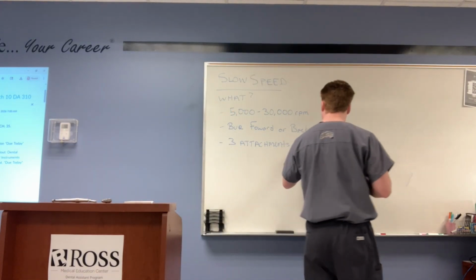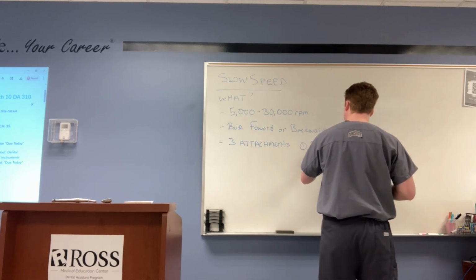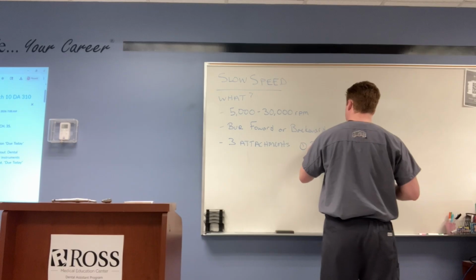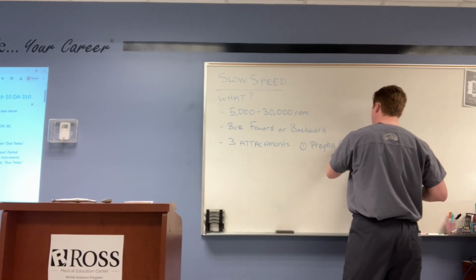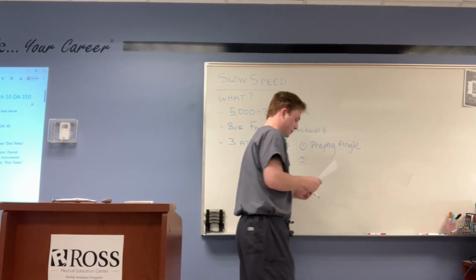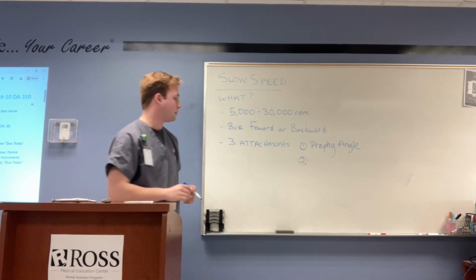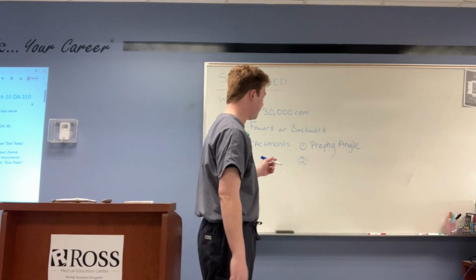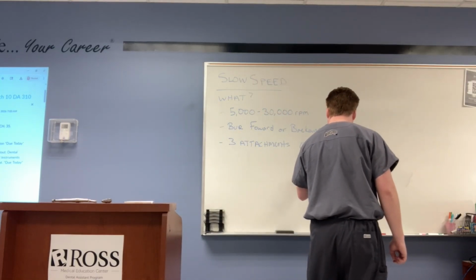One is the prophy angle. The second one is the straight angle, or just straight handpiece.